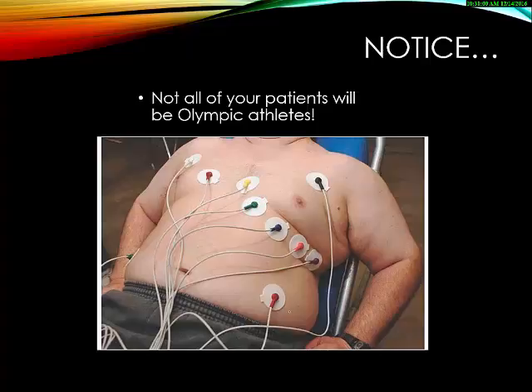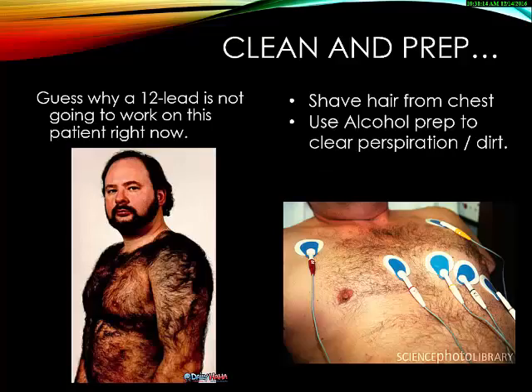And notice on this patient, they have made the mistake of putting the limb leads on the torso. So again, this is a no-no. Don't do this. This is going to cause you to have issues with getting an exact tracing.